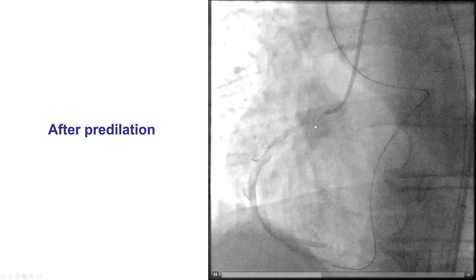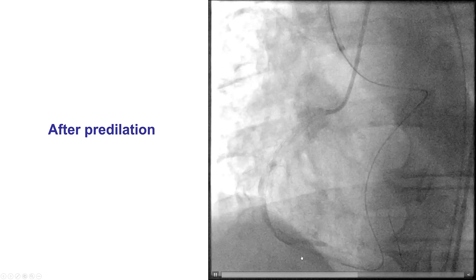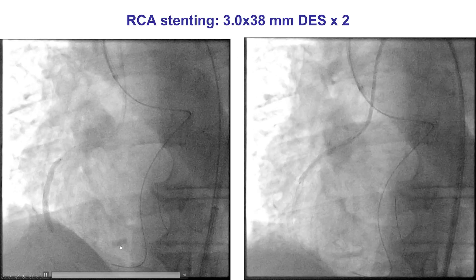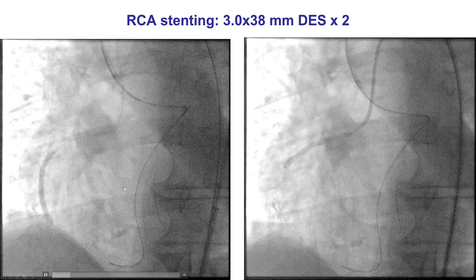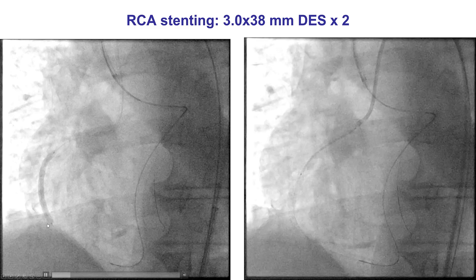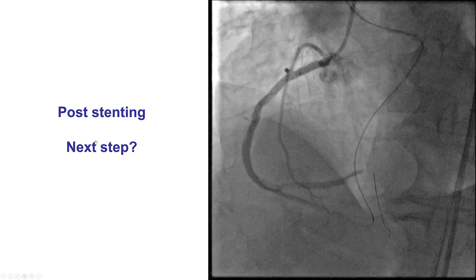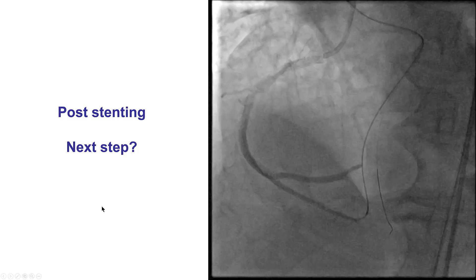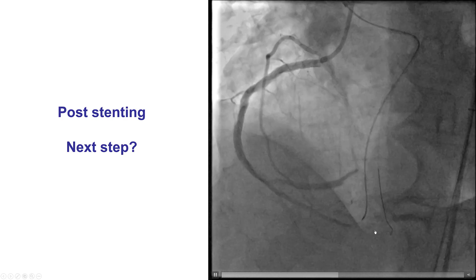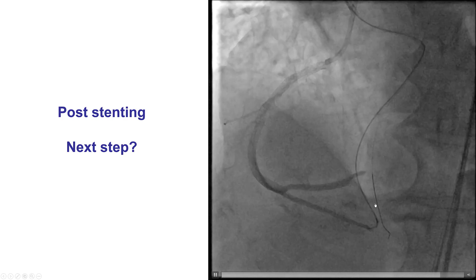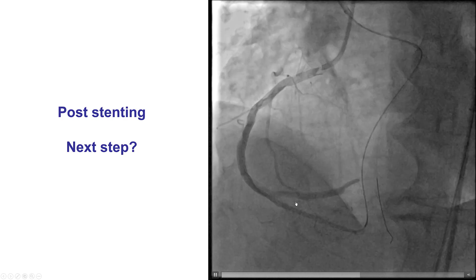Following that, we trapped and externalized and predilated. We did a small puff which showed that there was still persistent dissection. That is why we decided to stent without affecting the distal bifurcation. We placed two 3.0 by 38 mm drug-eluting stents all the way from the distal RCA to the ostium of the right coronary artery. Unfortunately, what we saw afterwards was persistent dissection — there was still subintimal dissection in the posterolateral without antegrade flow. The same was true into the PDA, which frankly surprised us because by going retrograde we thought we had secure distal true lumen wire position into the PDA.